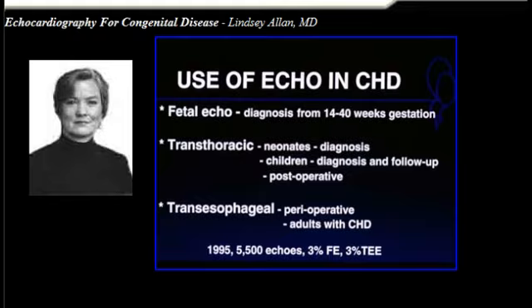Transesophageal echocardiography is becoming an increasingly important aspect of our practice. We only have had our transesophageal probes for a couple of years now, but now we're very reliant on it, and the very idea of not having the TEE in the operative room, the surgeons don't like that anymore. So we're committed to a lot of transesophageal echocardiography in the perioperative period.